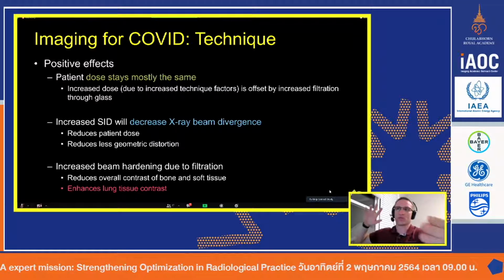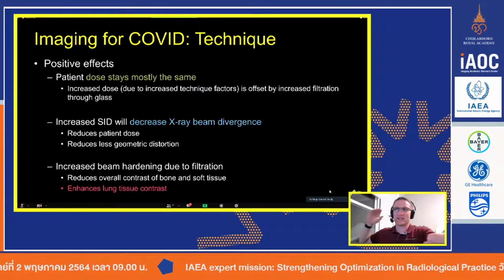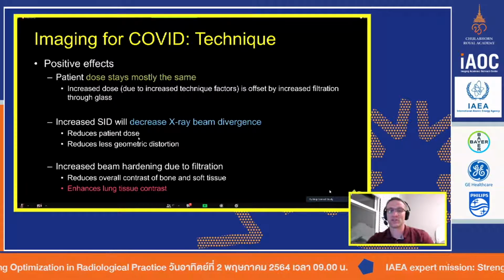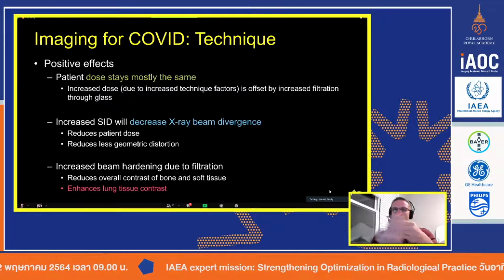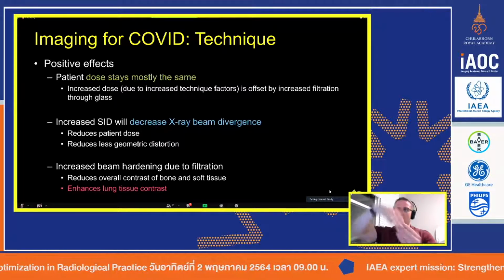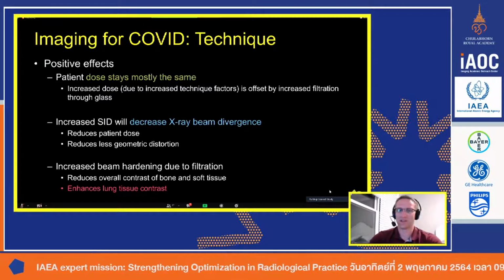Now, the beam, when you are super far away, obviously keeps diverging. But when you get all the way out and you collimate in, long SIDs make the beam more parallel. In other words, the farther away you get, the more straight on into the patient it is. And so this is actually a good thing. It helps reduce a lot of the geometric distortion, and it can help reduce the dose to the patient. Remember, the intensity is now going to be more uniform across the field of view instead of that heel effect. The heel effect is largely gone at very long distances. So dose-wise, it's a good thing. And for geometric distortion, yes, you're imaging at weird angles, but the distance factor will also help so that the edges are not as bad, and the image quality will be slightly better in some ways.